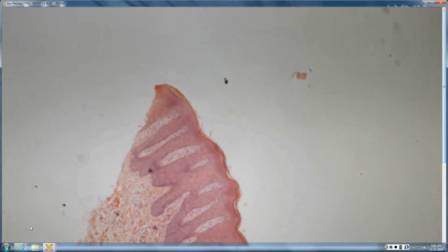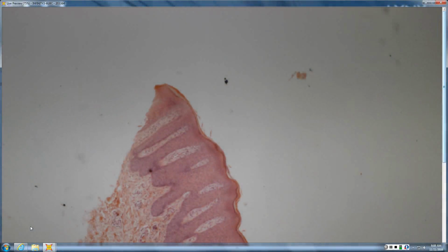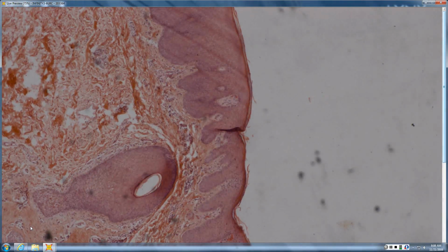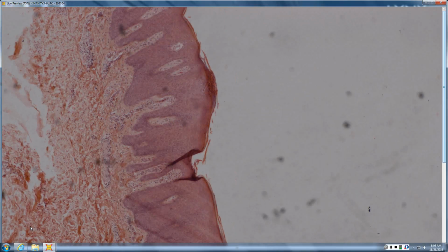So, one, look at all slides, all pieces on the slide. So first thing you do is hold up the slide, see how many pieces there are, make sure you've evaluated all of them. And run through your full differential. I agree that this piece is harder than the other.